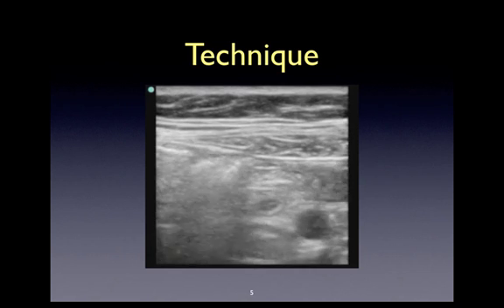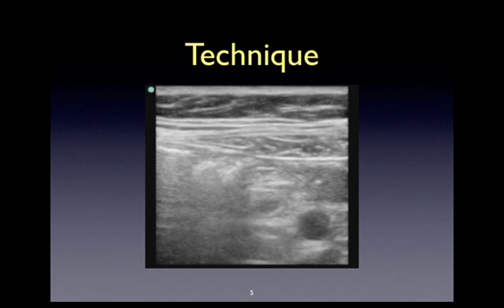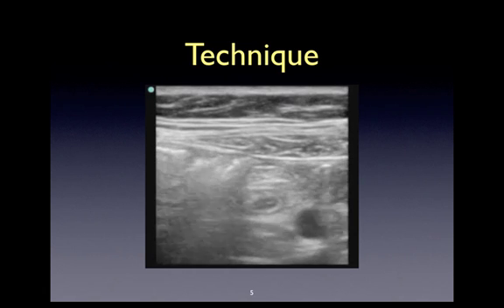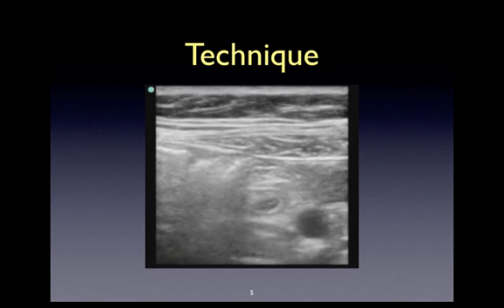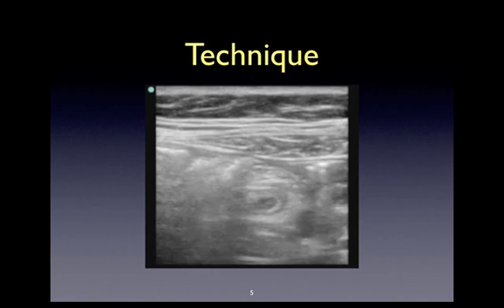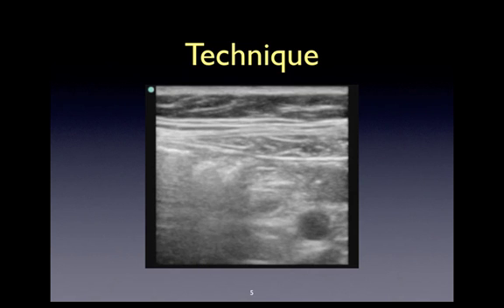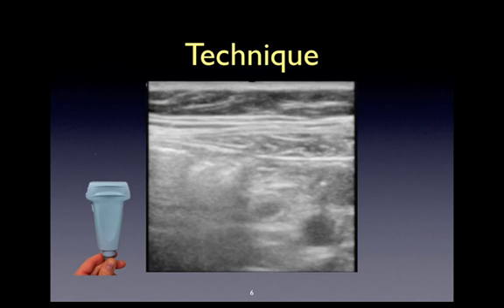Since there is often abundant air within the bowel, identification of the important structures of the right lower quadrant can be very challenging. The way to overcome this challenge is by employing the graded compression approach, which involves applying slow, gradual pressure with your linear probe to the right lower quadrant with the intent of displacing the bowel gas in order to better visualize the contents of the right lower quadrant. In this example, we can clearly see the appendix overlying the psoas muscle at the level of the iliac vessels.